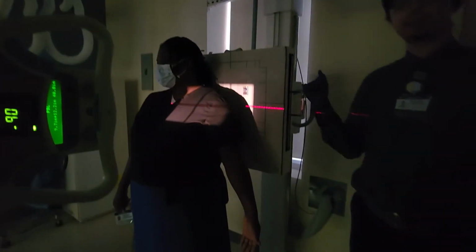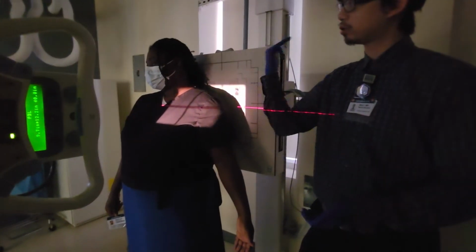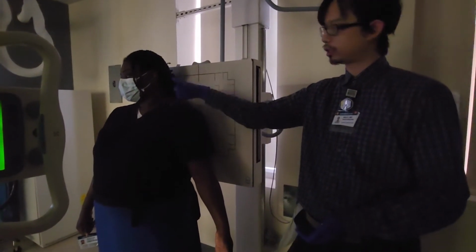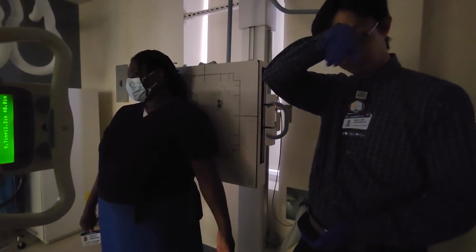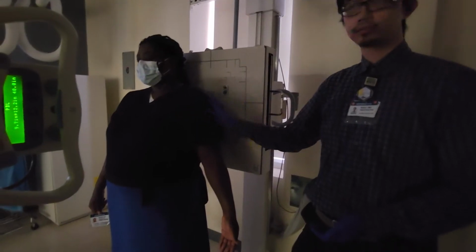Right? Something else you can do to help improve your image is ask the patient to also turn their head just slightly away, right? You don't want them facing you, you don't want the chin in the shoulder. So just have them turn their head slightly away. So are we okay with external rotation here?